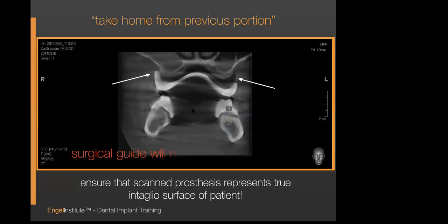Now remember this, okay? Read this to yourself, okay? The surgical guide will mimic the scanned appliance. So if you're scanning your own stuff and you're milling your own guides or printing your own guides and you don't catch this, God help you if this is your surgery.